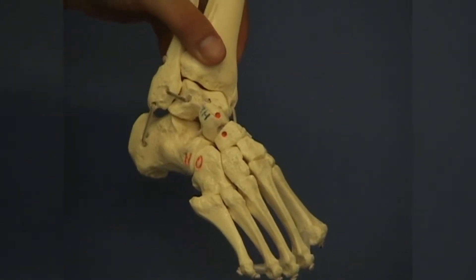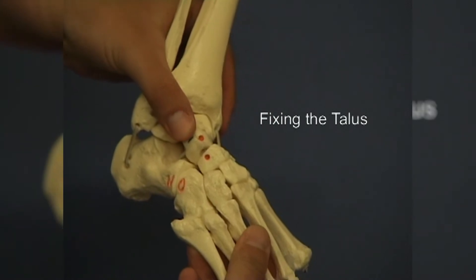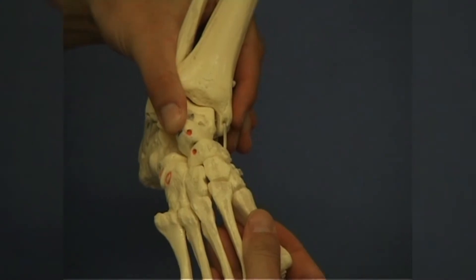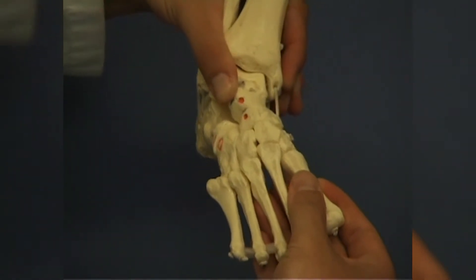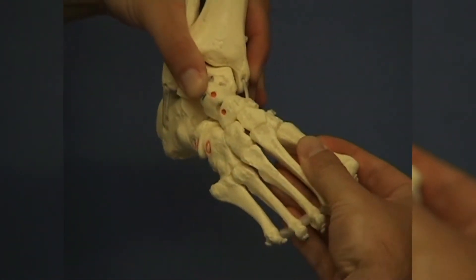The talus is kept in place using the thumb of the right hand without fixing the calcaneus at the same time. The motion of the calcaneopedal block around the talus can be seen clearly in abduction. Motion of the single joints in the midfoot is minimal and not relevant to correcting clubfoot deformity.